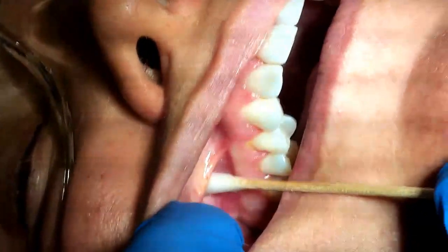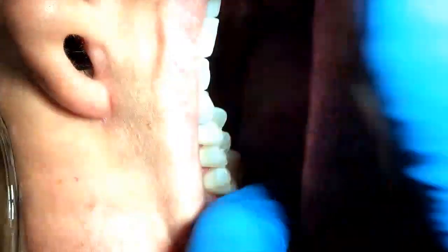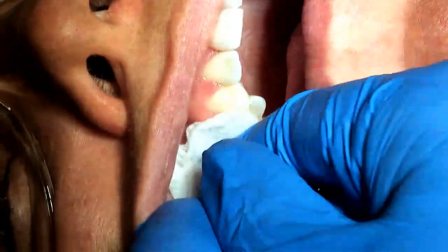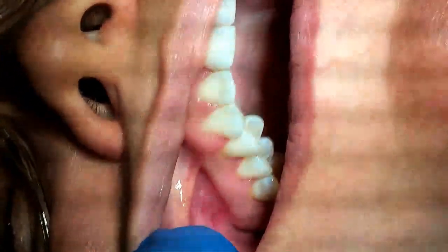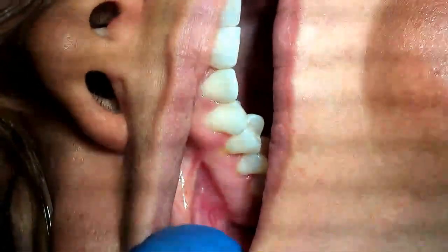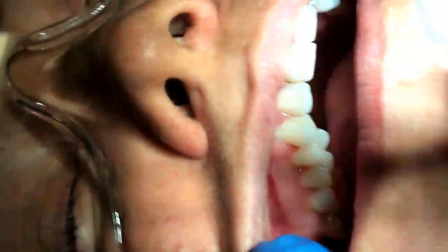To prepare our site, the first thing we want to do is dry the tissue. You want to dry the tissue and remove any debris that might be in the injection area — just a nice gentle dab with the gauze to remove any debris or any excess saliva. That's going to help clean the area.